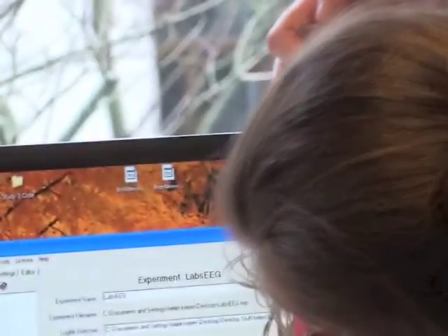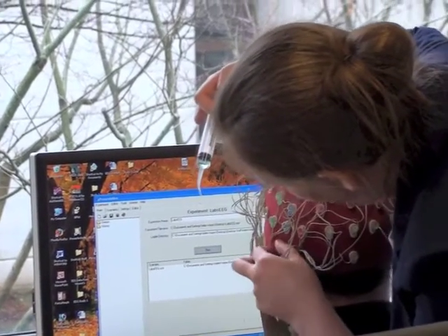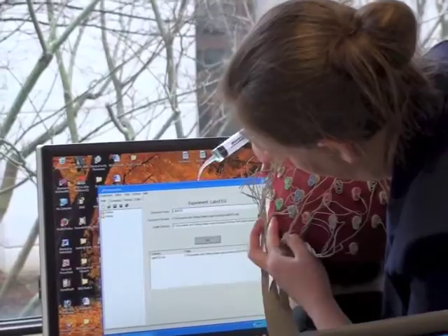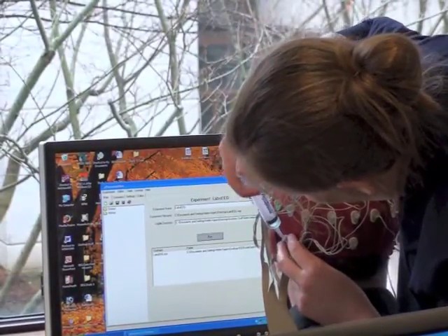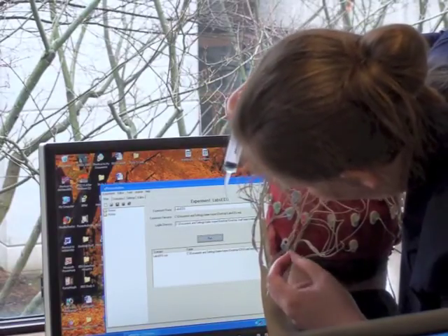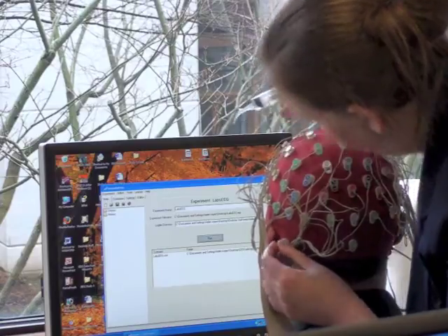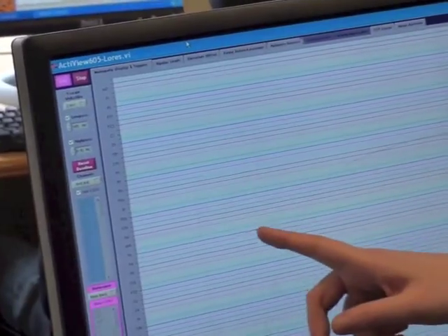Okay? So I just take my gel and I go to the electrode. P9, here it is. I can tell that it's because your ear is pushing it away from the scalp. So I'm going to put more gel in. Put the electrode back in. And see, yeah, this is going to be okay now. You see how that's fixed that? Just by putting more gel in.